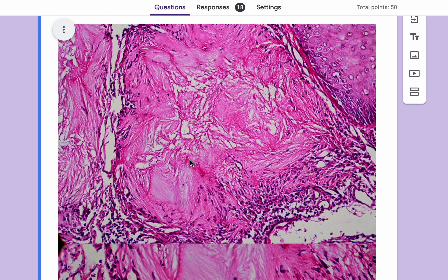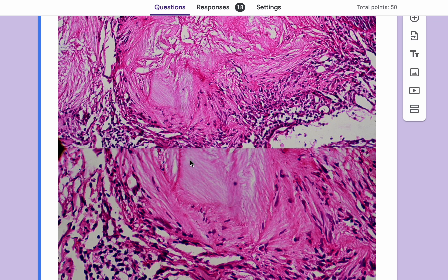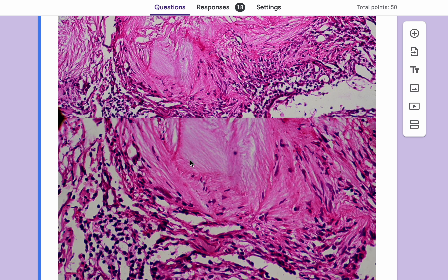These are urate crystals. Urate is usually dissolved in formalin-fixed sections, so you need alcohol-fixed sections to see the urate deposits. However, this is a pretty classical histological H&E picture on formalin-fixed sections, and you don't often need special stains or special fixation methods if you know what you're looking for.